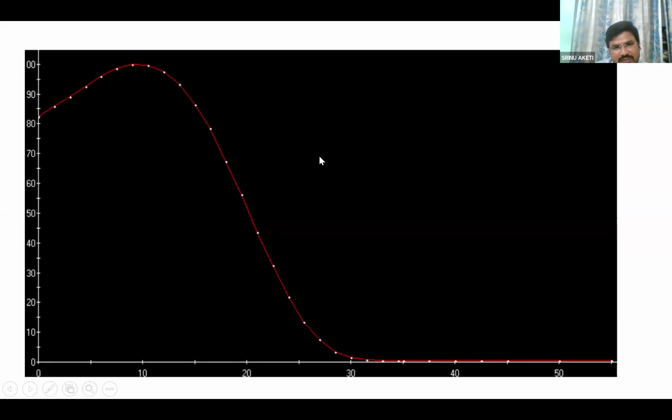No, I will tell you. See, this dose is deposited by the electrons traveling in the electron beam, for example a 6 MeV or 8 MeV electron. This dose is deposited completely by electrons. This you can see now. This we call the practical range. Till this level, this is the dose deposited by the electron. That is the practical range. That means the electron travels up to that level and deposits dose up to that level. This is completely dose deposited by electrons.